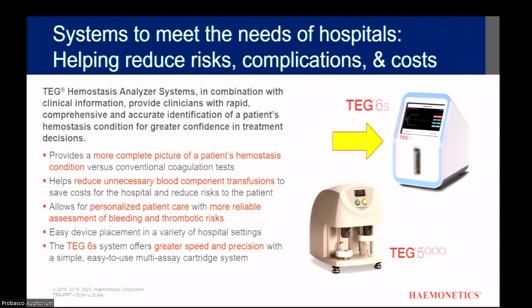You will get 4 tests in one. It's no longer an a la carte ordering style, and everything will show up on the screen in the lab, as well as in TEG Manager, which will be a new viewing software that you will have. I just like to show people that it is quite a nice upgrade from old to new.